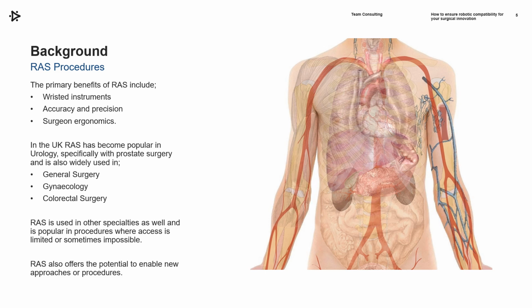They provide the surgeon with much more dexterity compared to a laparoscopic instrument. So that makes things like suturing specifically much easier. With that wristed action, you can tie knots and pass the needle around much more easily than with a straight stick equivalent. The systems also allow much increased accuracy and precision due to being able to scale movements. So you can scale a movement from the surgeon input at the console right down to a much more precise and small movement at the surgical instrument tip, allowing for much finer dissection or precision of control on where you want to cut or things like that.